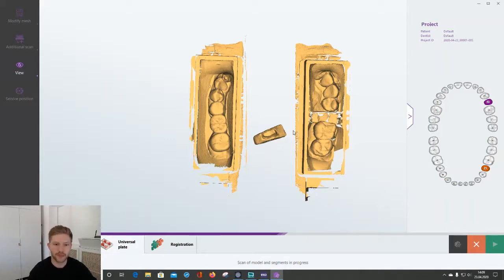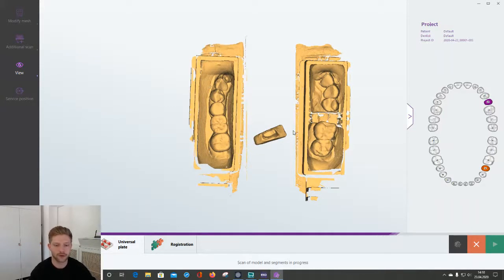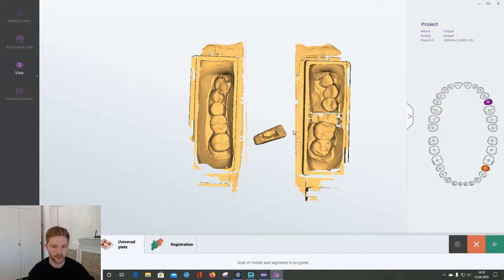We just have to wait a few more seconds. By the way, everyone who is using a Vinyl can order the 4-teeth bar if you do not already have it. There's no activation code needed for this. You just need the little adapter, and afterwards you can start scanning twin tray models.